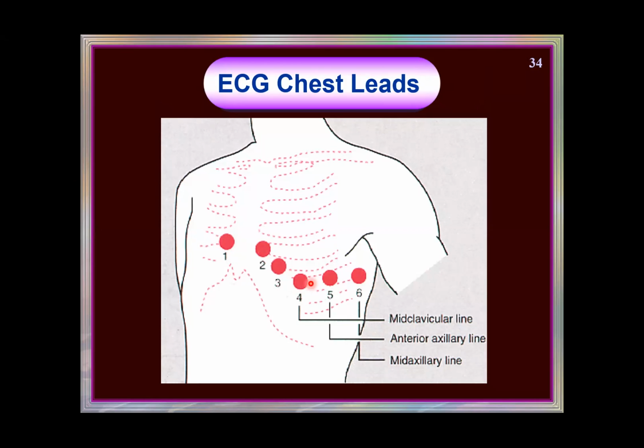So there are 3 here on the left side, particularly V5, V6, V4; V5, V6 are the left cameras. Now imagine the heart as a box. How many surfaces will a box have? 6 surfaces, isn't it? So in this box of the heart, the upper surface, the anterior and posterior join there, so there is no upper surface.